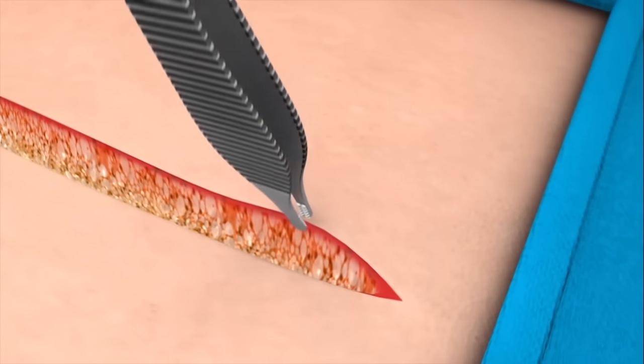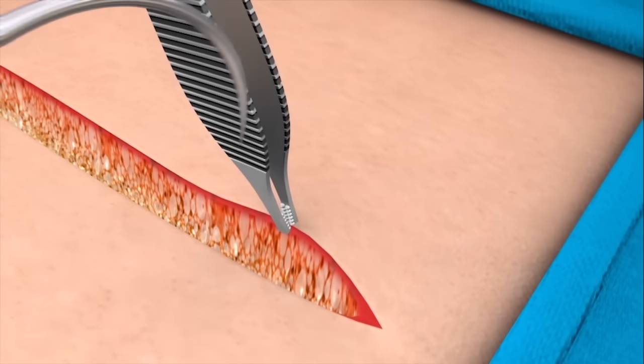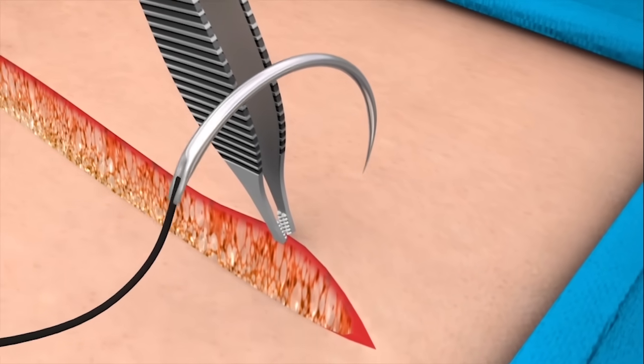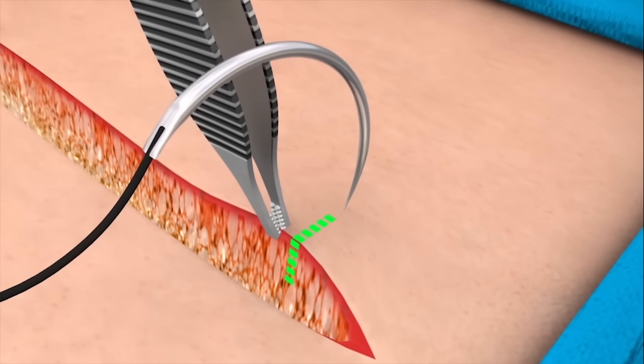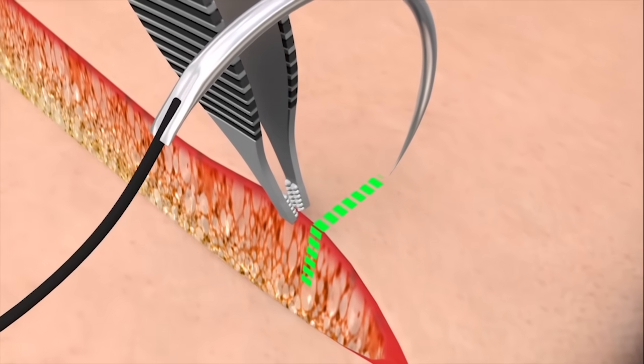Use the toothed forceps to very gently lift the skin edges and hold the skin when inserting the needle. Take a slightly larger bite than normal to start the vertical mattress suture.